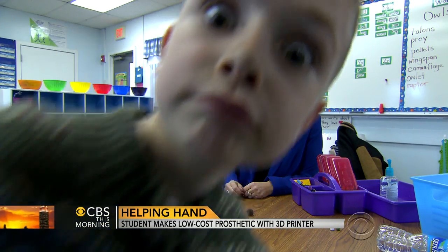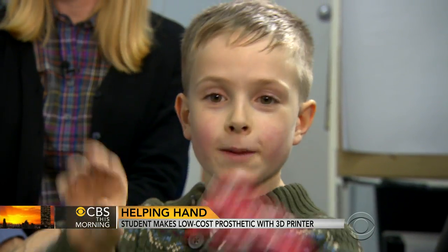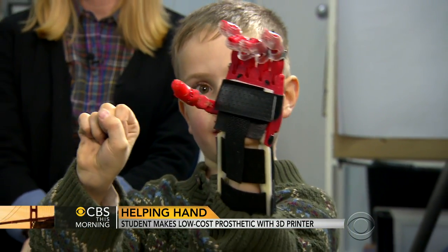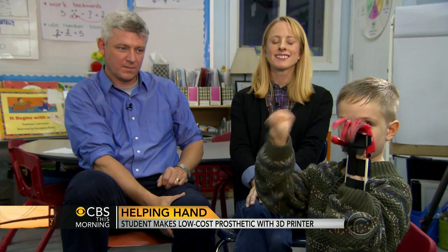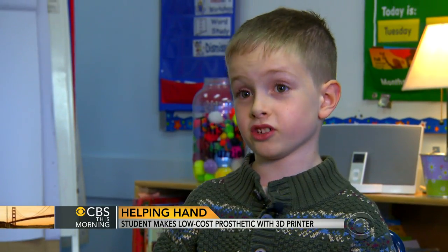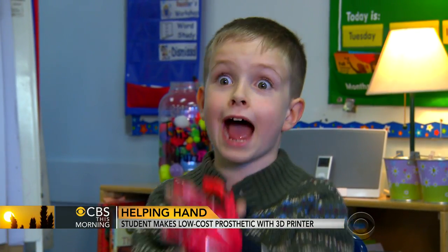Ask first grader Holden Mora how his new hand works and he'll be happy to demonstrate. When I bend my hand in like this, it closes. When I bend it this way, it opens. At seven years old, he's become an expert on the workings of this novel device made out of plastic for roughly $20. It's an amazing $20 — normally the materials cost a lot, about like a thousand.